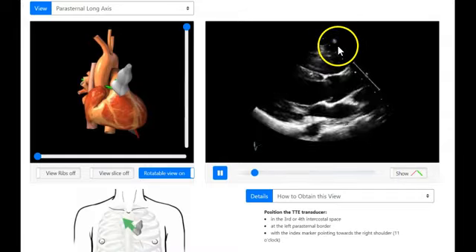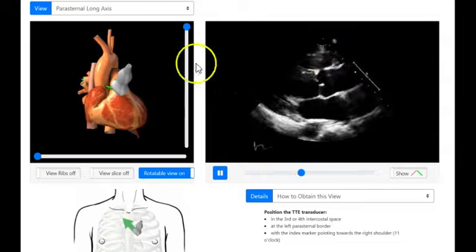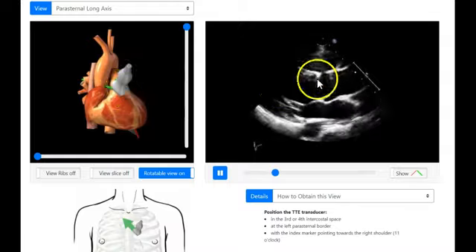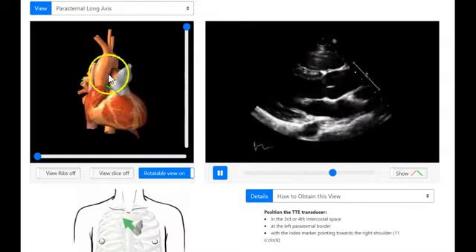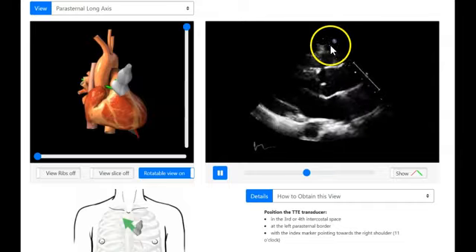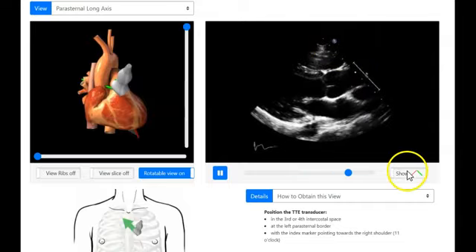You can see the marker right up here, which is where the orientation markers, the index markers, point. Whatever that's pointing at should show up on this side of the screen. As you can see, that does. It's pointing up towards the aorta here, and the aorta's over here. But there's a P right there, a placement marker. So I'm going to go ahead and turn this on.